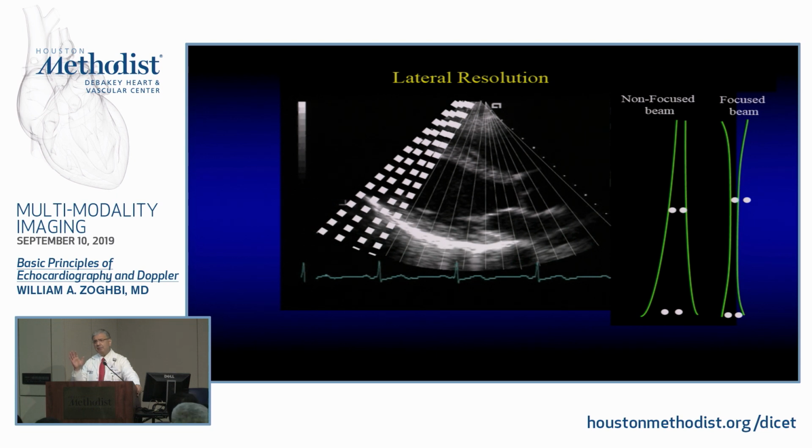I'll give you an example of where lateral resolution becomes a problem. If you tell me I want to measure left atrial area by echocardiography, and volumes, most of them are done from the apical window, right? The atrium is way down, and part of the lateral resolution issue is the dot becomes like a little line, so that you could see encroachment of ultrasound into the left atrial cavity.